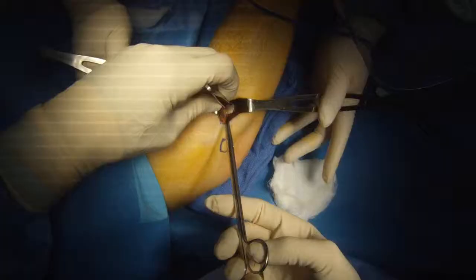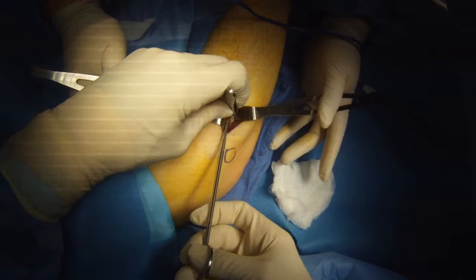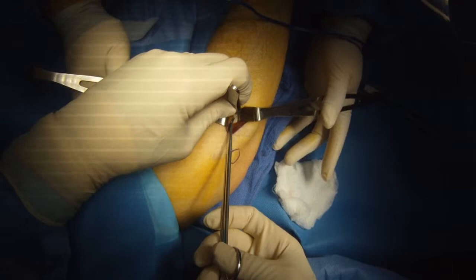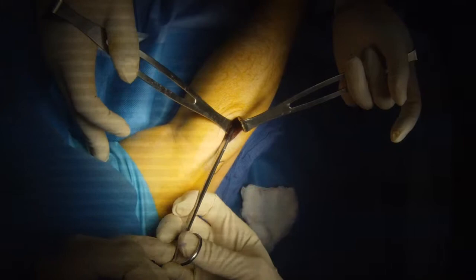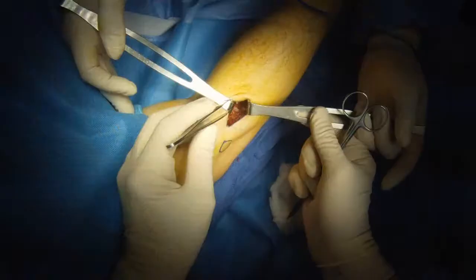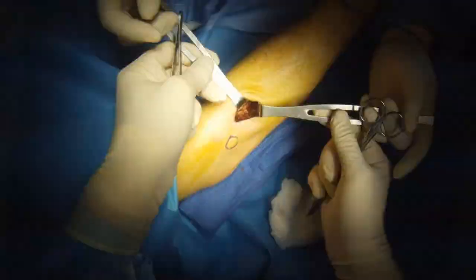Beneath it is constricting the nerve, so we cut this away. In order to free the nerve, we take small bites and make sure we're cutting only what we want to cut. There, you can see it release, and now we just make sure that we've got the whole fascia arcade released.